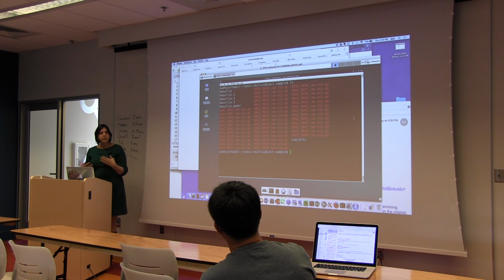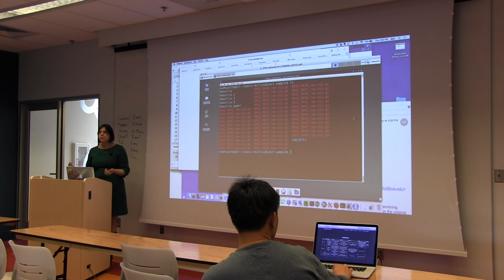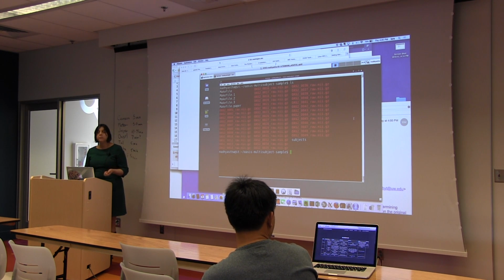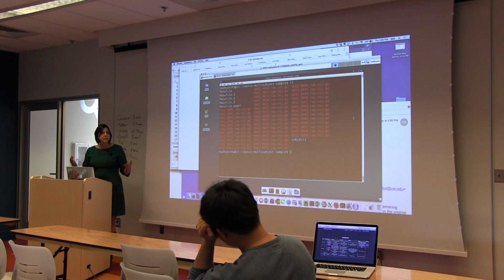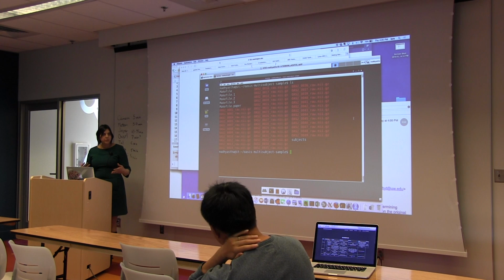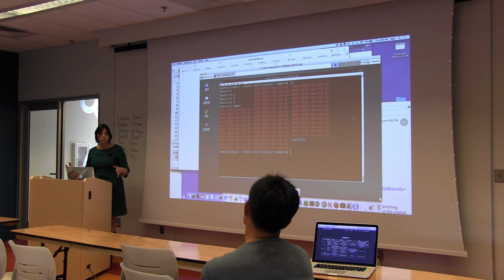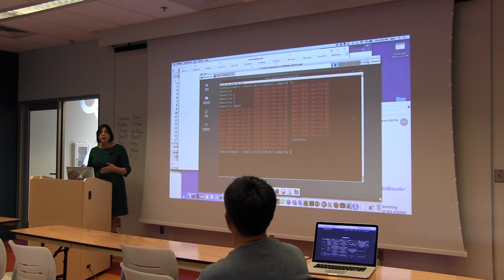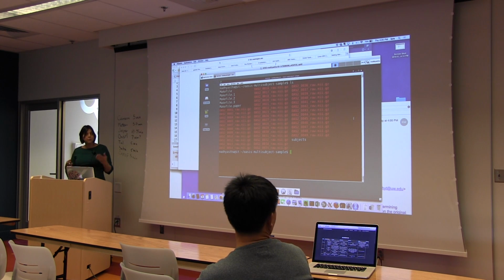You can copy it to your own directory, but I have two example sorts of data sets. The one we're looking at right now is a cross-sectional data set. This is the processing that occurs, for example, if we have a bunch of FLAIR images and we want to do white matter hyperintensity quantification. It only relies upon the FLAIR image, so all you have to do is apply a sequence of things to calculate images that quantify the white matter hyperintensities, and you might just do that all in one directory. The other type of processing is a more complex longitudinal pipeline where you have subjects with multimodal acquisition, and for each one of those modalities you have a bunch of stuff you do.